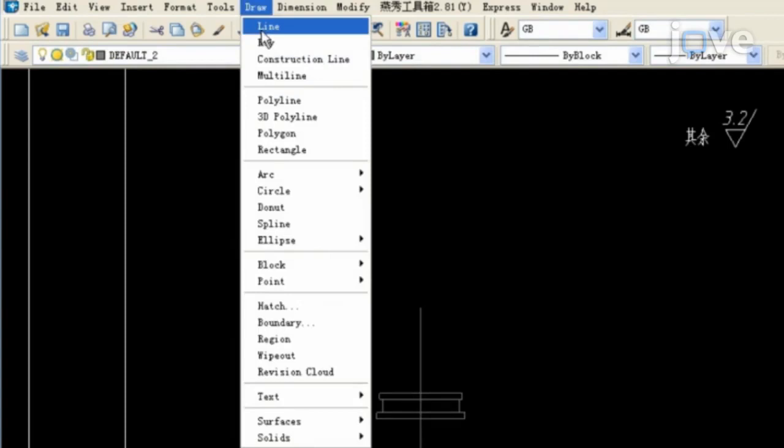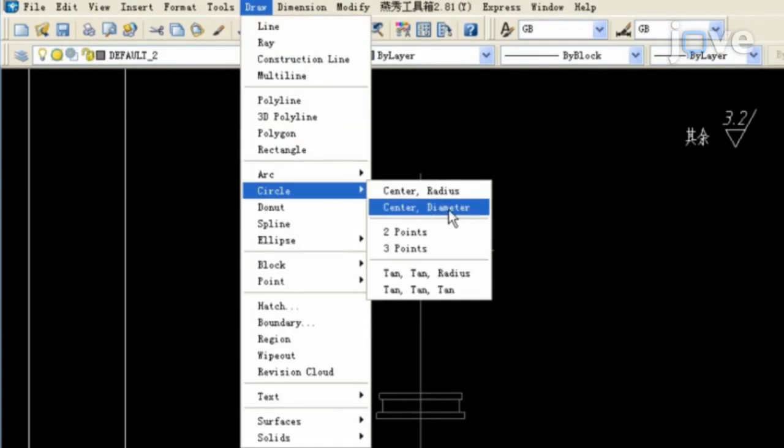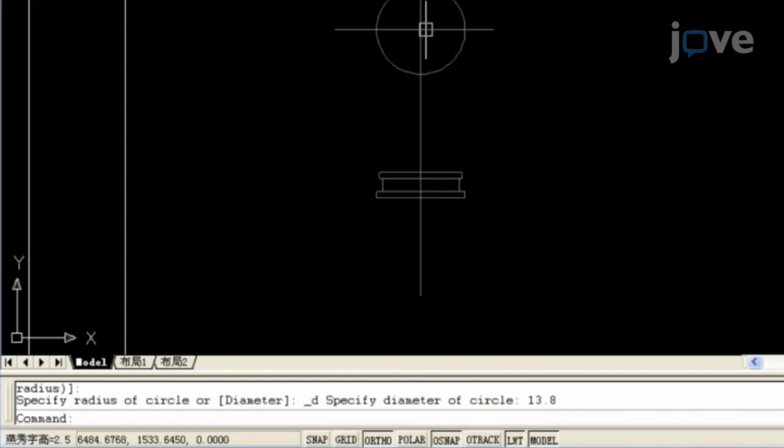To draw the top view, click Draw and Line to construct the reference point and click Draw, Circle, and Center Diameter to input the quantitative value of the specific radius of the circle or diameter in the command window. Then click the center of the reference point to form a circle.